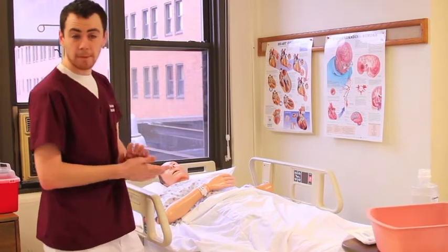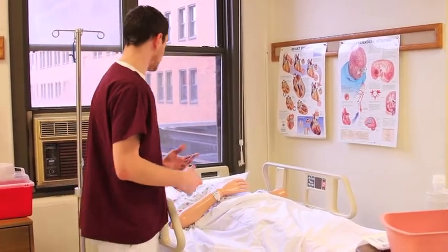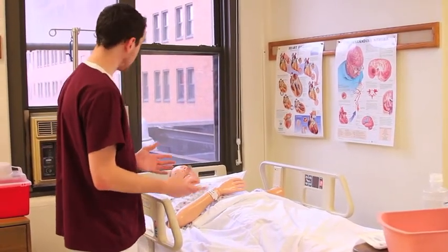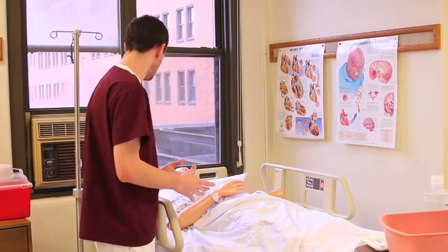Alright, he's feeling okay. And then we're going to go ahead and explain the procedure to him. Sir, as I've probably done this to you before, you do have a dressing, and we're just going to change that, clean it up, and try to help prevent any infection or anything along those lines to get you out of here a little bit faster. Is that alright?